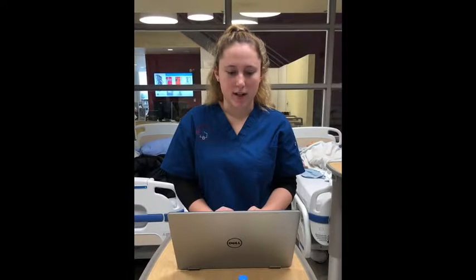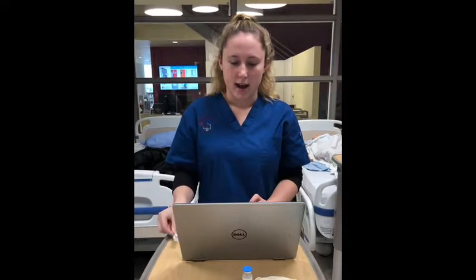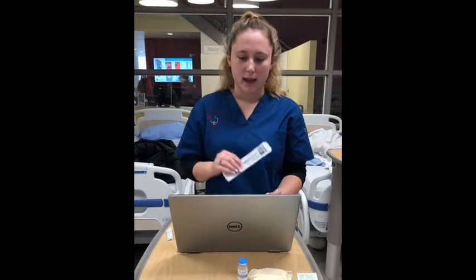For a subcutaneous injection, I will be using a 25 to 27 gauge needle. So I'll be using this needle here, and it would be 9.5 to 16 millimeters in length. And for an intramuscular injection, it would be 20 to 25 gauge. So this one right here I'm going to be using, and it would be 25 to 38 millimeters.